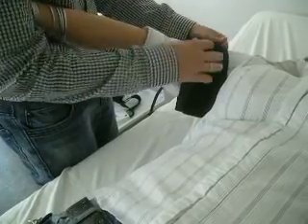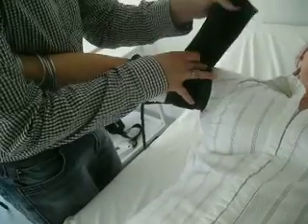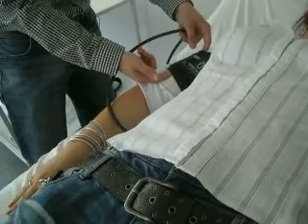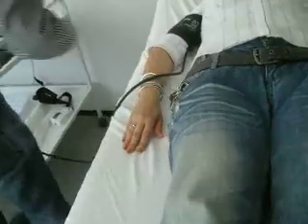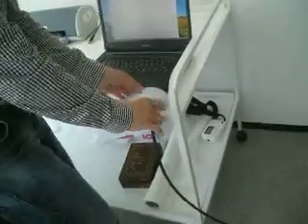You can leave a thin layer of fluid between the cuff and the arm. If it would be too thick, I would ask the patient to take it down. Now, this is how you put on the cuff. Okay, so you can see that it is quite tight. So my finger just hardly can be inserted beneath the cuff. And this is how you attach the tube to the device. So that's how you make the system ready for the measurement.